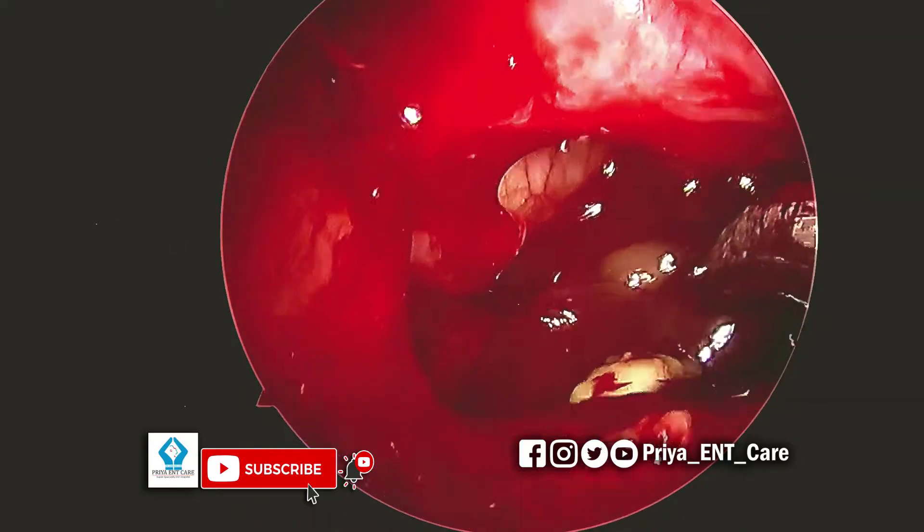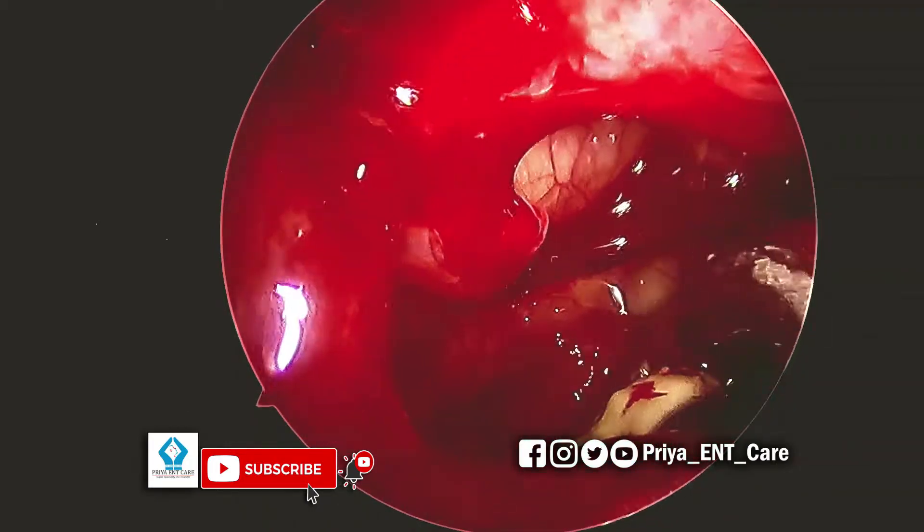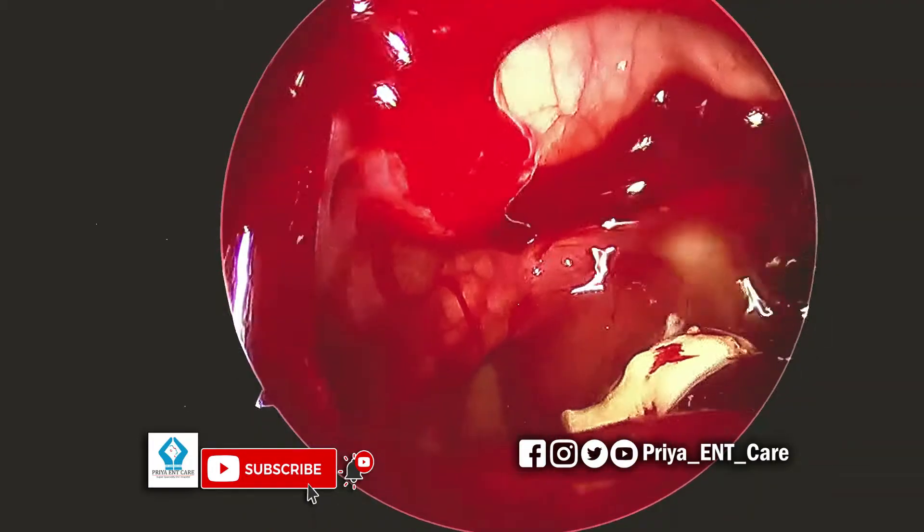A 90-degree microdebrider blade is used to remove the polyp from within the antrum.